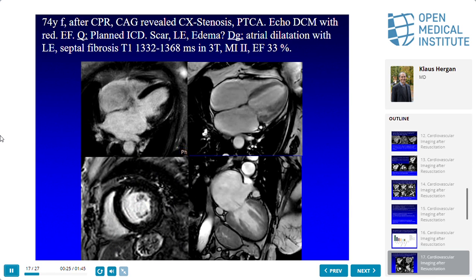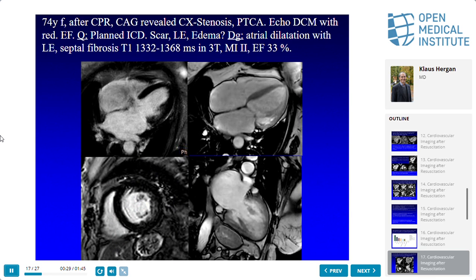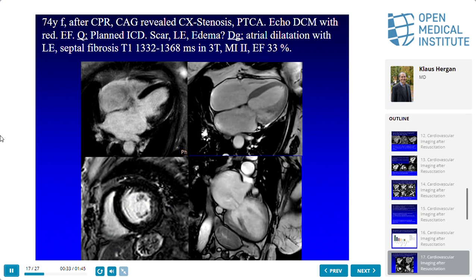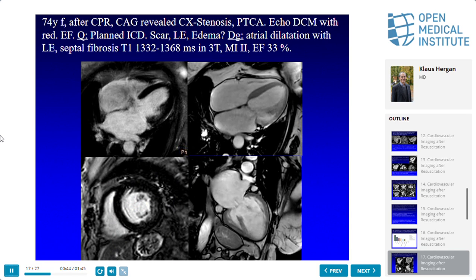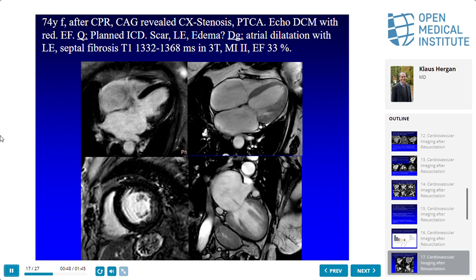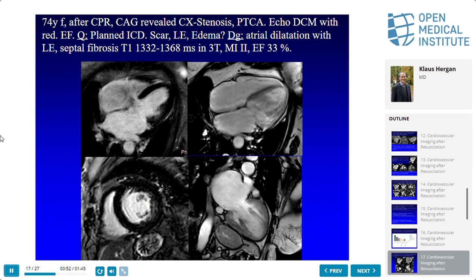Usually those patients get an MRI in our hospital, so they know a little bit more, because you can do imaging with implanted ICDs, but you can have artifacts there, and it's more complicated and takes more time. So it makes sense, if you're interested in the microstructure of the myocardium, to do MRI before implanting an ICD.